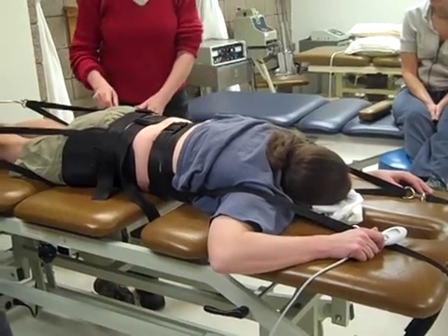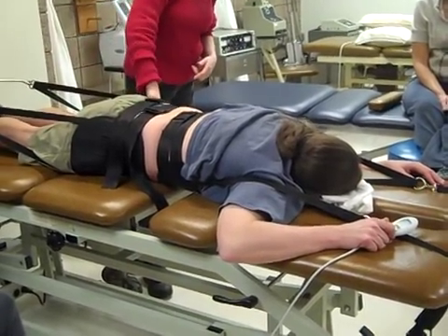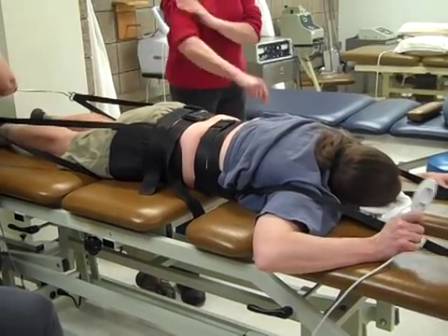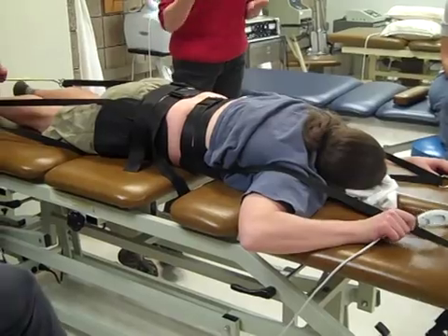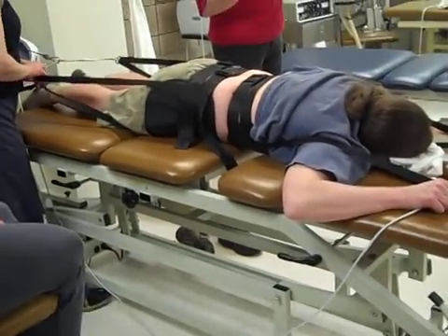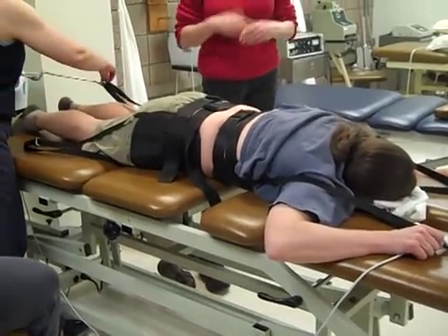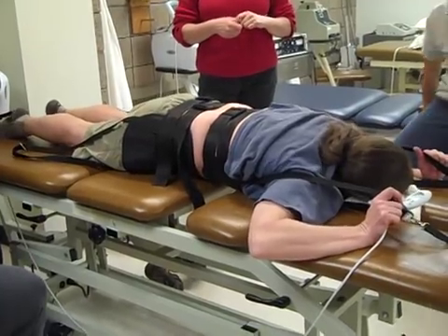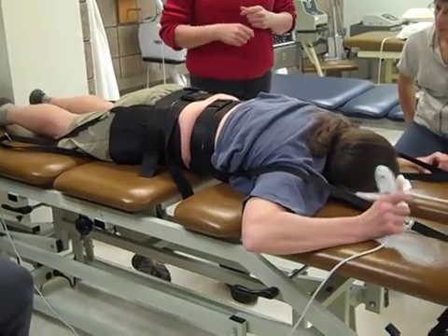Okay? If you're doing the prone one, there's one of these harnesses that says prone harness. Okay? There are belts. What you'll find now when you go out in clinics is they're universal. It's not ambidextrous, but you can use them forward or backward. Yeah, they have that cut out on both sides. Good job.